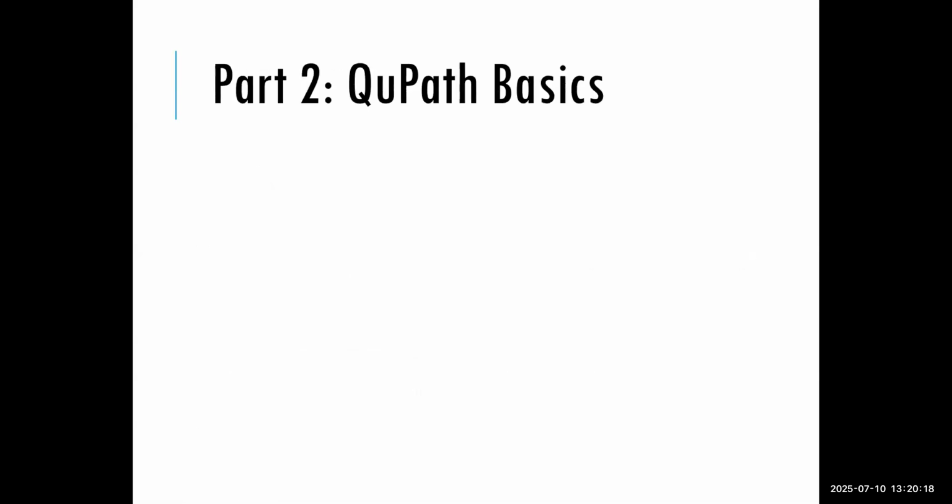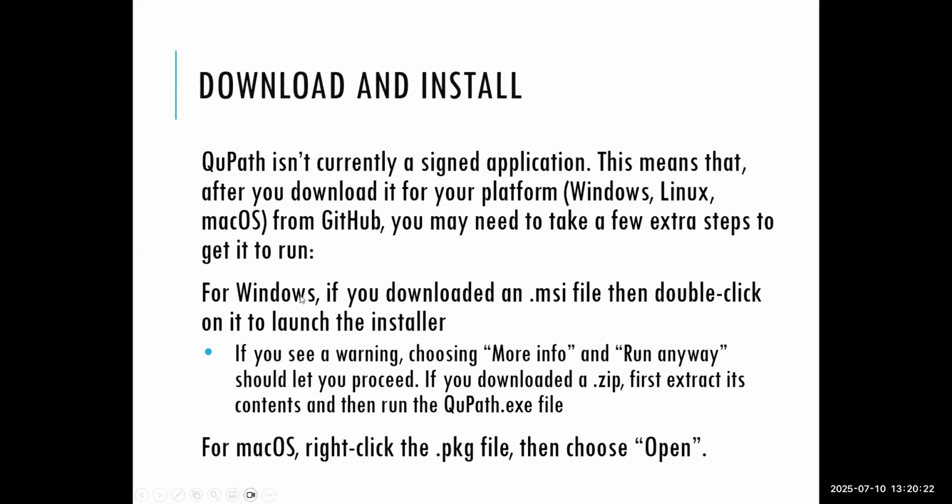So that's QuPath in a nutshell. Now we'll go over some QuPath basics. QuPath was just released as of last week, version 0.6.0. Previously, we had 0.5.0. I'm still navigating 0.6. It looks almost the same. There's a lot of functionality that they've added, but the general functionality between 0.5 and 0.6 should be basically the same if you have 0.5 already installed.